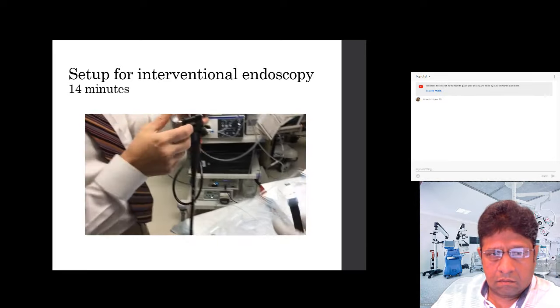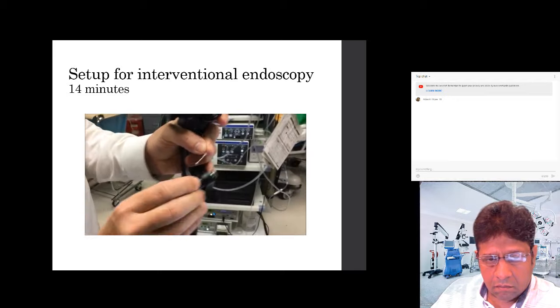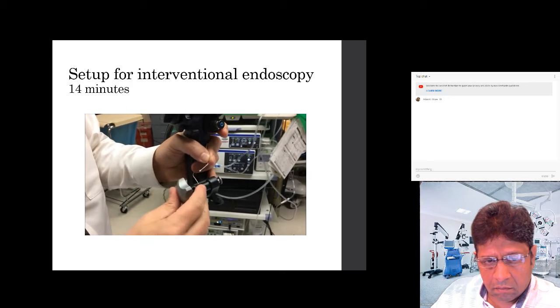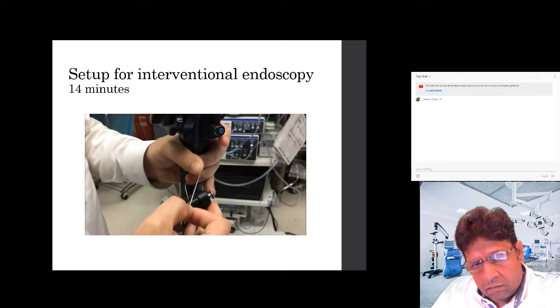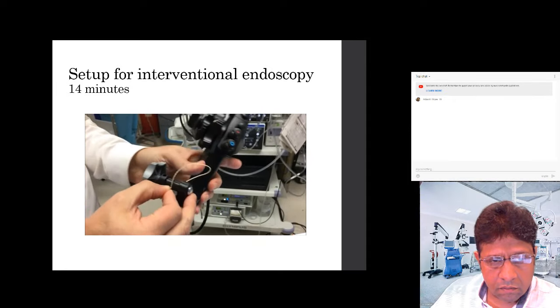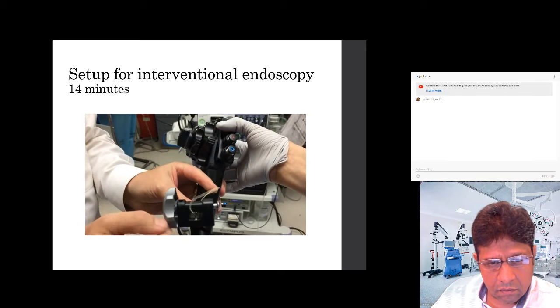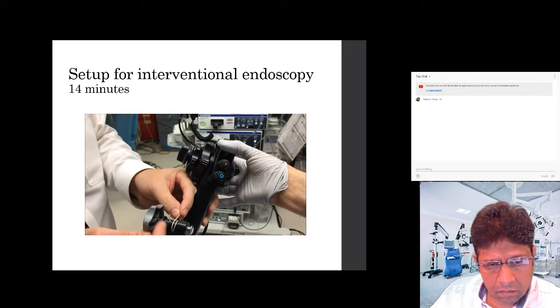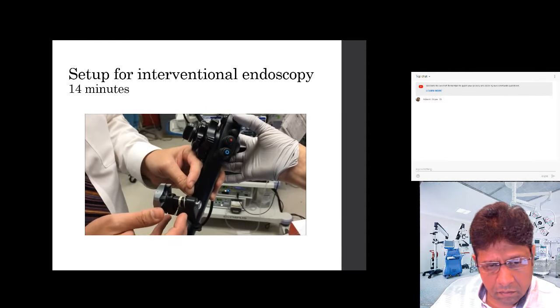Okay. And then, if you look over here, depending on how you have the dial, in this case, it's going in one direction. If I pull it back, now it only goes in the other direction. It doesn't matter, whatever you're comfortable with. There's a little slit here. You basically pop this into this slit, and I'm not putting it down, so it's hard to. I'm just gonna shift my hands here. So that goes into that little slit like that, and then you just kind of roll it up. Let me make sure so it rolls nice and tight. Yep, exactly right. Roll it up, and now once you feel a little tension, now we're ready.